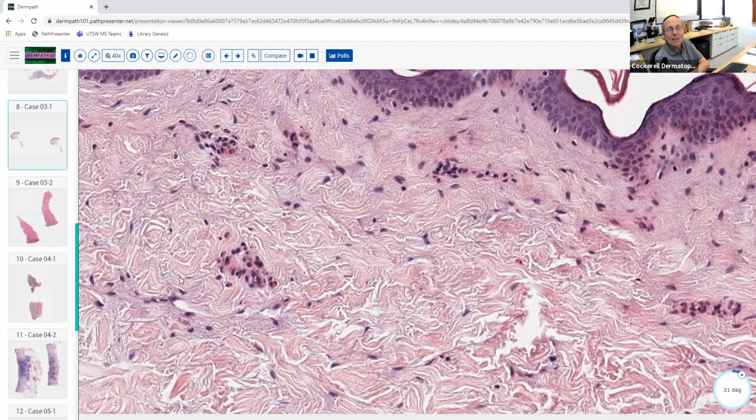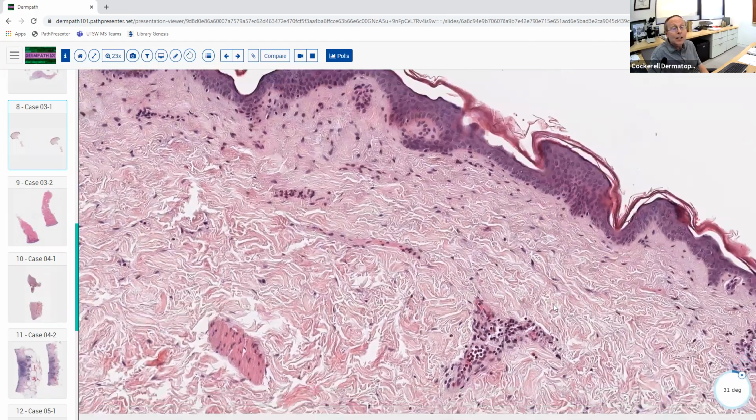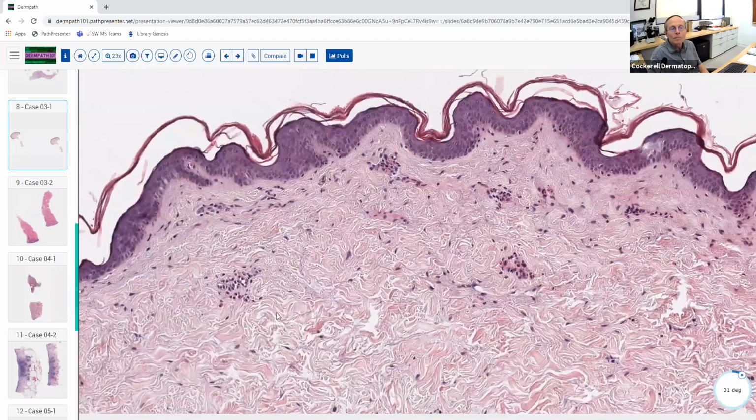But what disease classically gives you a very sparse infiltrate with some neutrophils, some eosinophils scattered like this? It's really sparse. Shows almost very limited inflammation. Look at it under the microscope, like here. A drug can cause this, but that's not the actual diagnosis here.